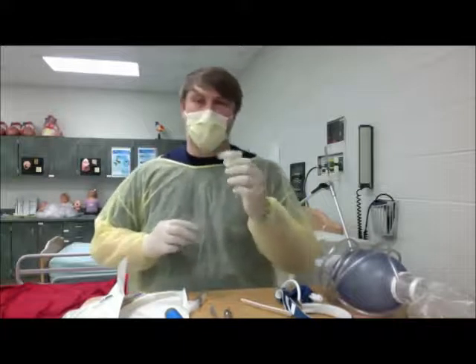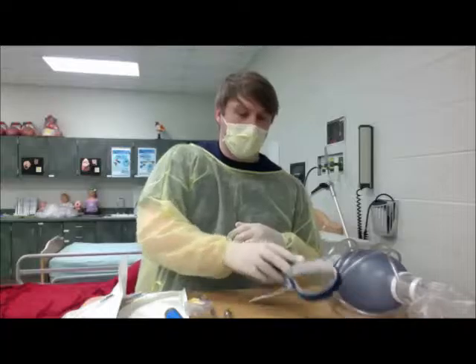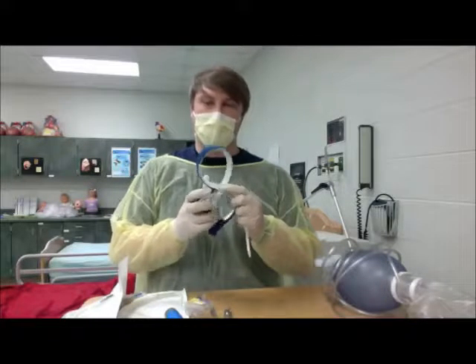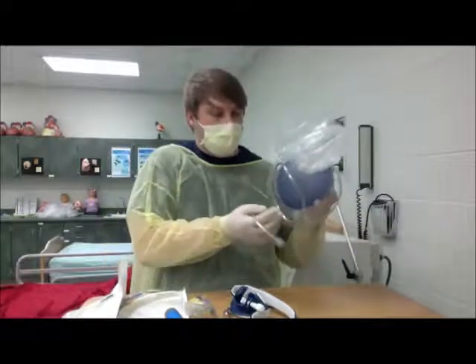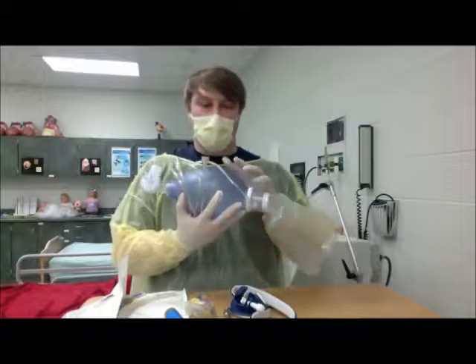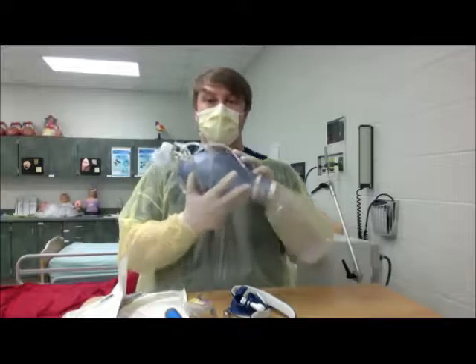We have a colorimetric just to make sure that we're in the lungs. We have an ET tube holder after we secure the airway and make sure it's there. We're going to put this on there to secure it. Also, we're going to have a bag valve mask. So it's the number one thing that we need to have so we can bag them right after, or if we don't get the intubation, then we'll just bag them.